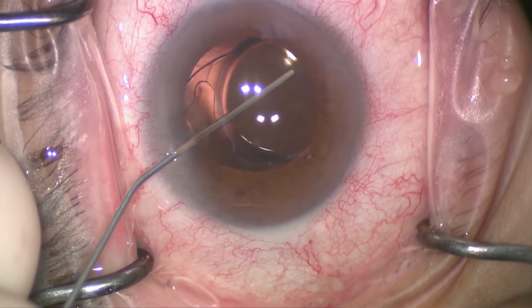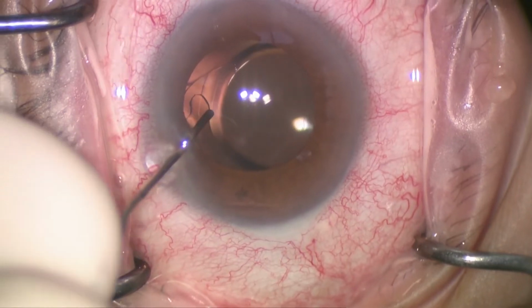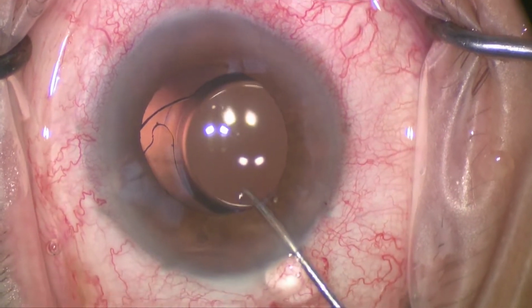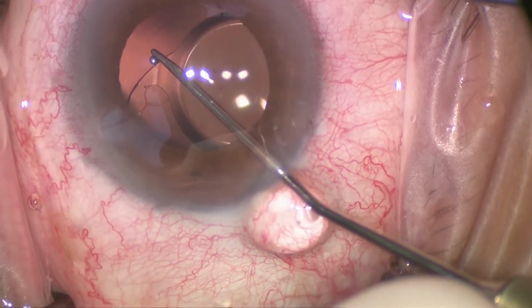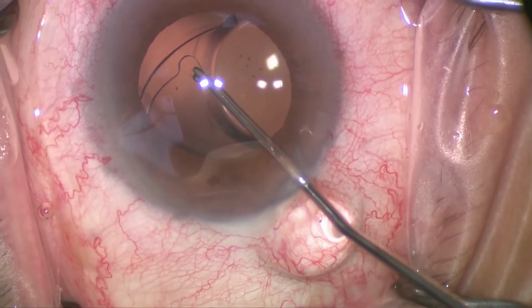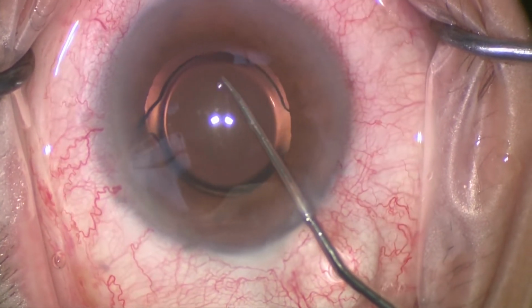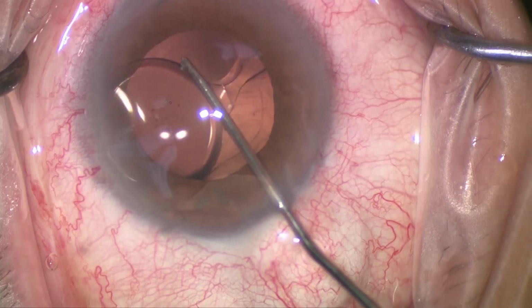After filling the bag and anterior chamber with viscoelastic, the cannula is used to test the mobility of the lens. Manipulation with the Malyugin manipulator instrument shows that the lens is freely mobile within the capsular bag. The lens is then easily dialed out of the capsular bag and into the anterior chamber with no impediments, behaving similarly to a lens that had just been placed in the original surgery day. There was no obvious damage to the haptics or haptic-optic junction of the lens.